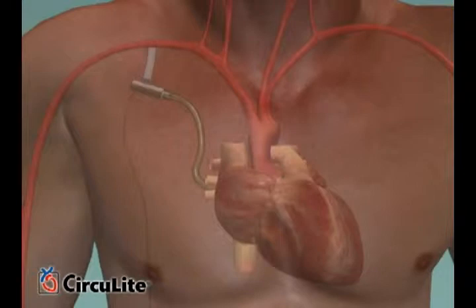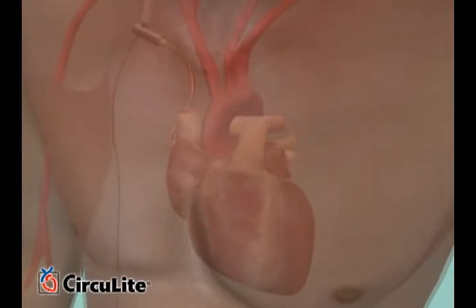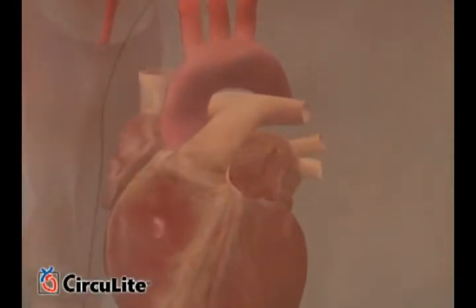Let's see how Synergy works to enable the heart to rest and potentially to enable beneficial recovery of heart function in patients with New York Heart Association Class 3B or early Class 4 heart failure.